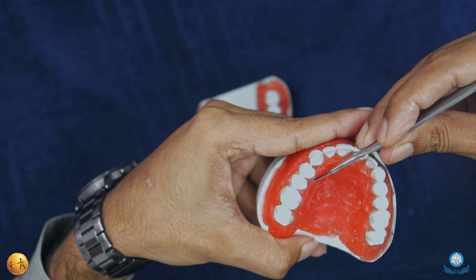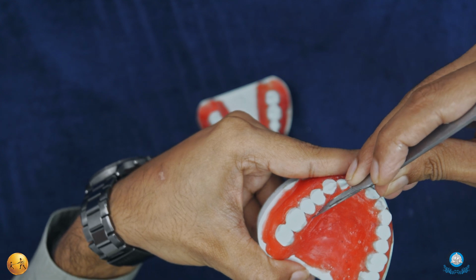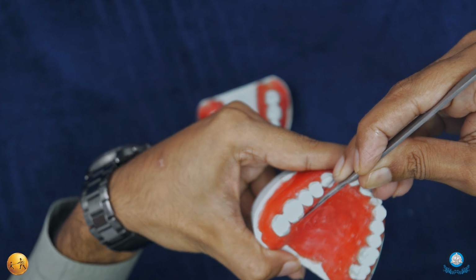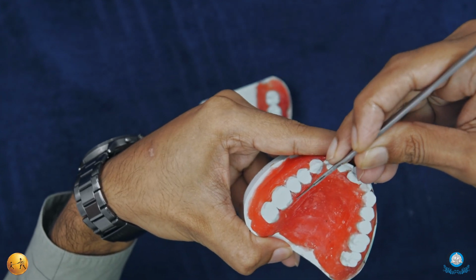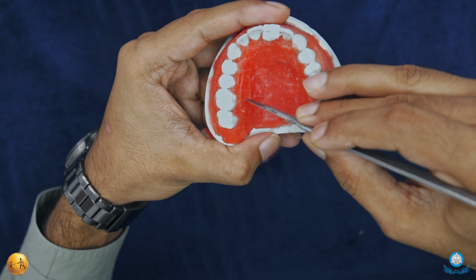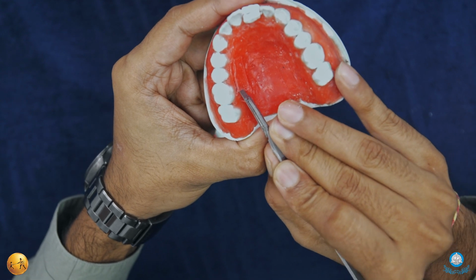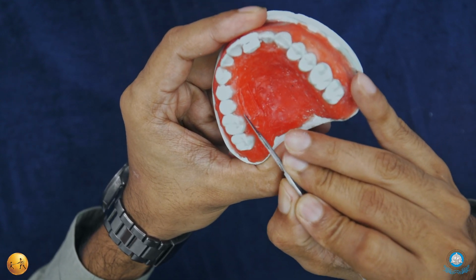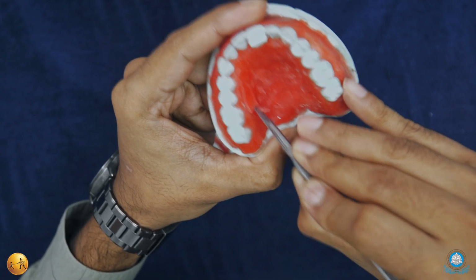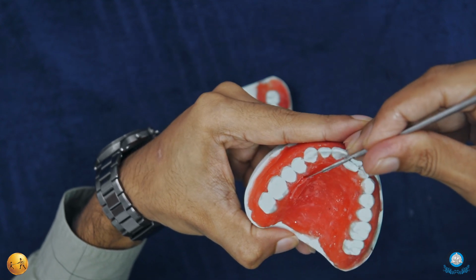Once you achieve that, start reflecting it along the borders without getting too deep. Because there is a greater palatine artery below this graft, you need to be very careful about how deep you go. That's why 1 to 1.5 mm is an ideal thickness for a graft.